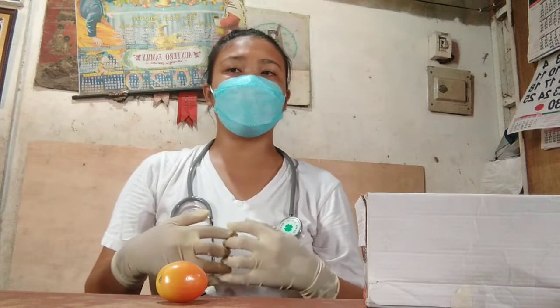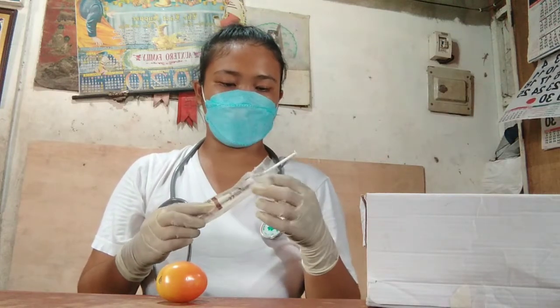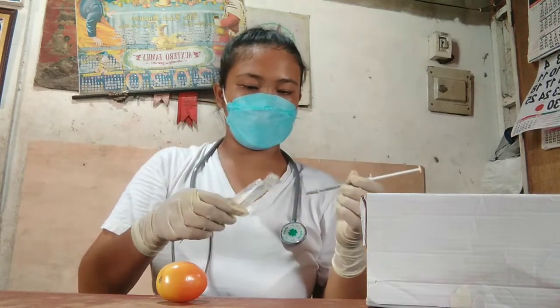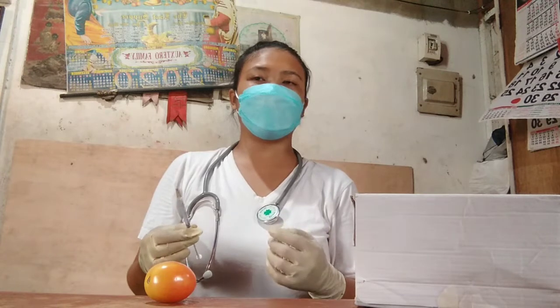Next, remove the needle cover and discard it without contaminating the needle. This is to make the equipment prepared for the next step. Next, hold the syringe between the thumb and forefinger of the dominant hand. Inject the needle quickly and firmly at a 90-degree angle and insert the needle into the muscle.